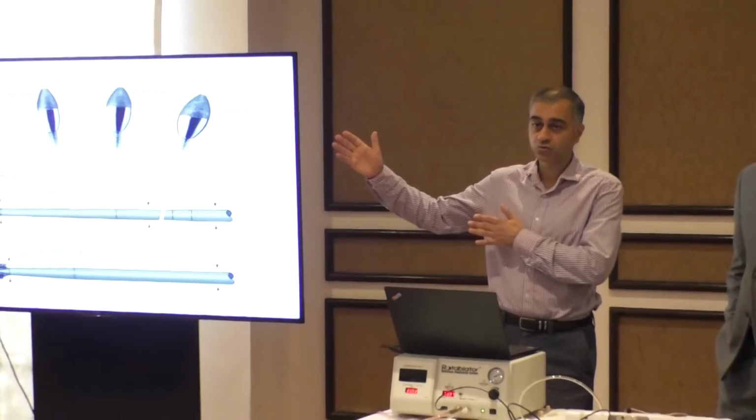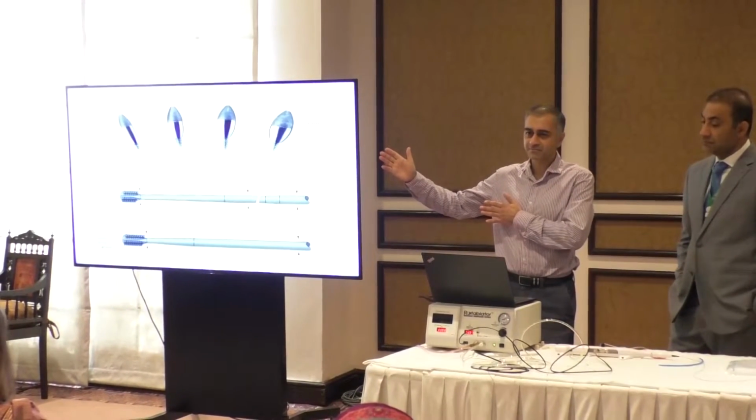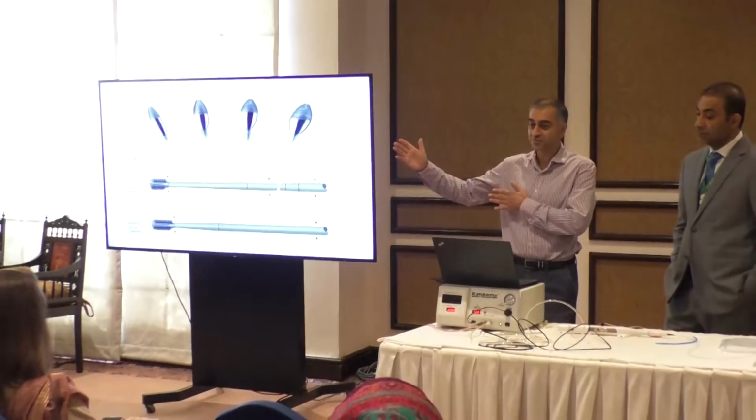There are two factors you can change in the rotation. One is the rotor wire, and there are two types of rotor wire: a rotor floppy wire and an extra stiff wire. And then the other thing that you can change is actually the burr itself. The burr will change in size from a 1.25, and I think it goes all the way up to a 2.5 possibly. I have to say I've never used 2.5.